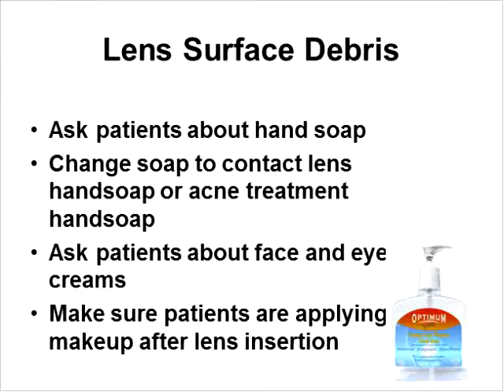Ask patients about what type of hand soap they're using, and also about when they're applying their face and eye creams and also makeup. This should be after the insertion of the scleral lenses. Change soap to contact lens hand soap.